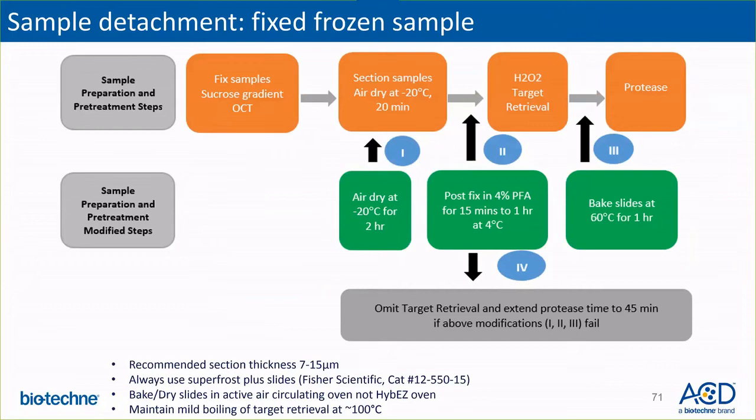After trying the above steps 1, 2, and 3, if you are still observing detachment, we recommend to omit the target retrieval and extend the protease time to 45 minutes. Also, please contact technical support and we can help you to figure out the best troubleshooting path for this issue.